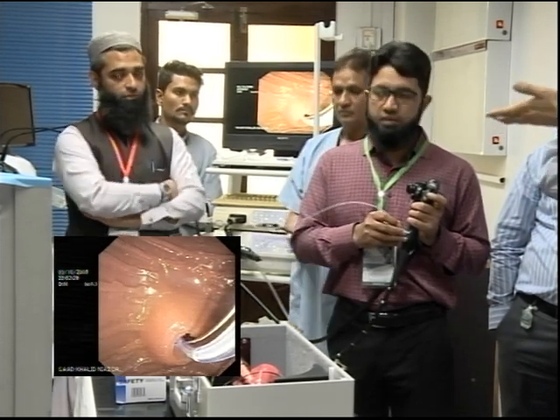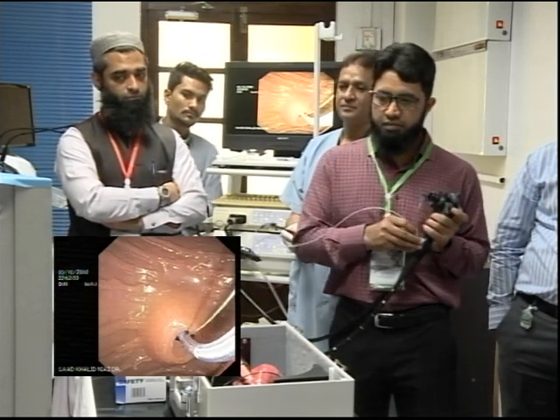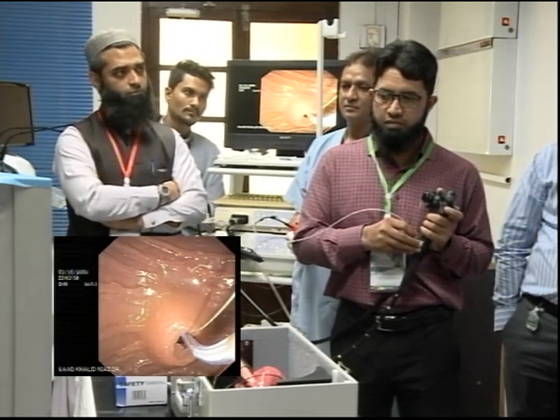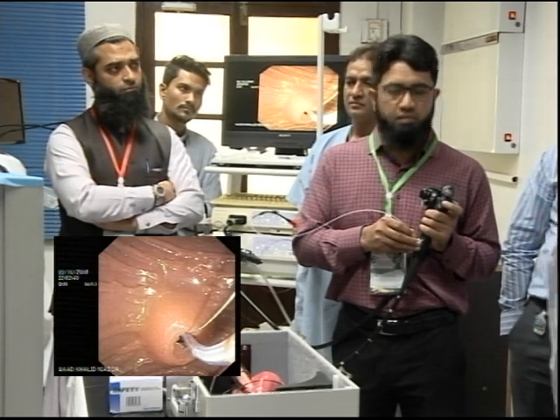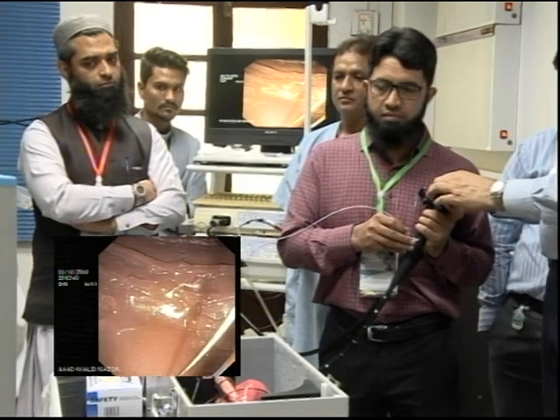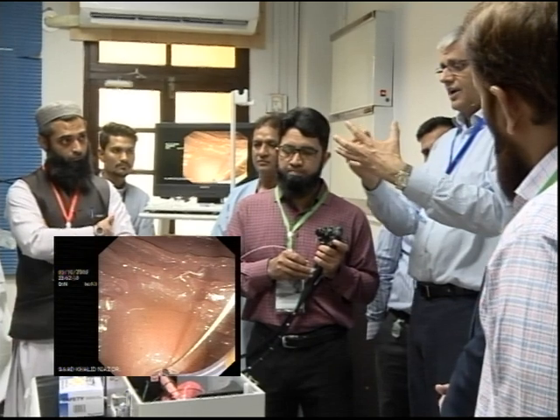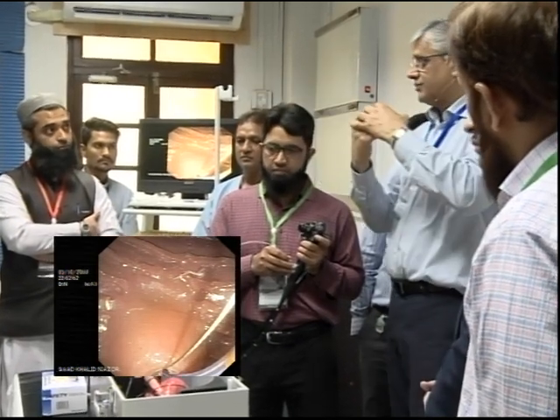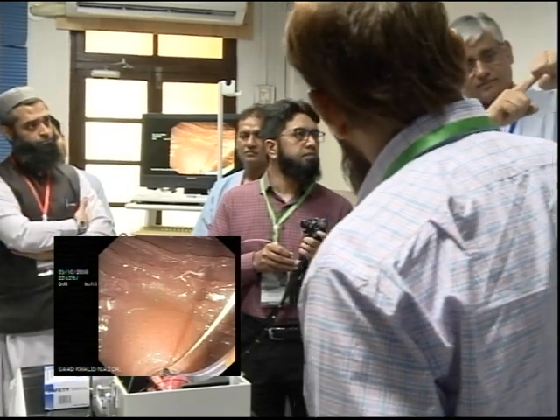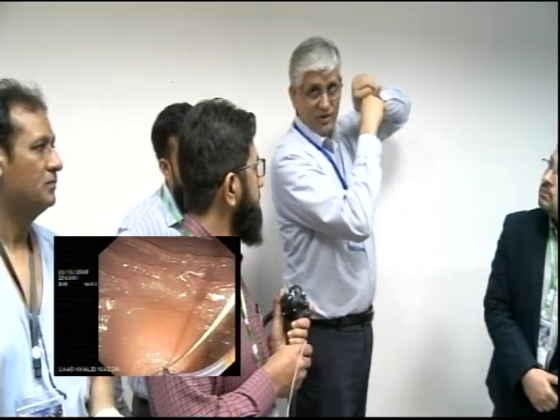You can use the bow. So bow karo, Akram. Okay. Once you've got this bow, and supposing you're in, now if you bring your big wheel, abhi aapka band hai, if you bring it towards you, what happens is, this is what I was talking about. You can either advance, or you can bring your ampulla close to you. You have the cannula, theek hai? You can either advance this like this, or you can keep it still where you want and bring it close.